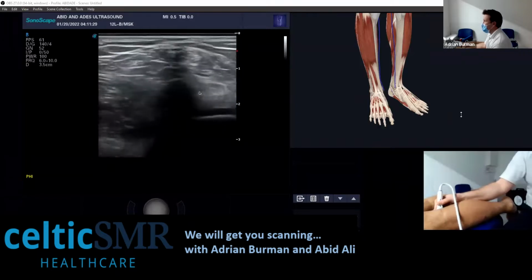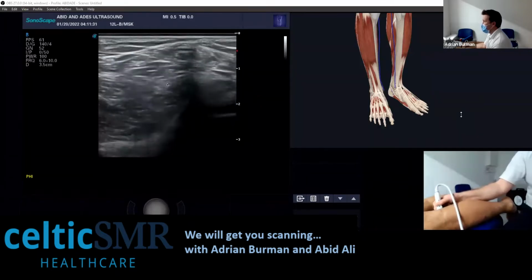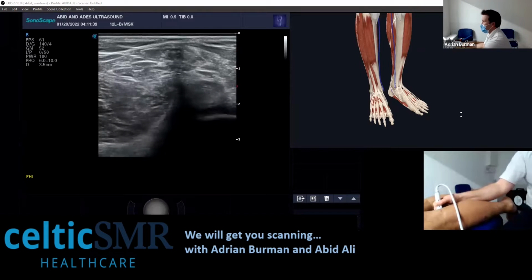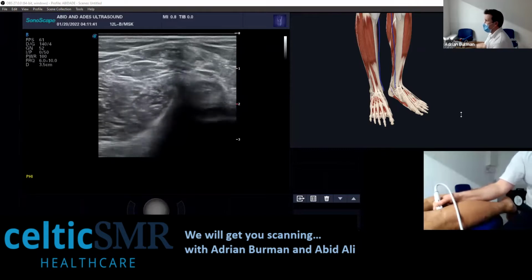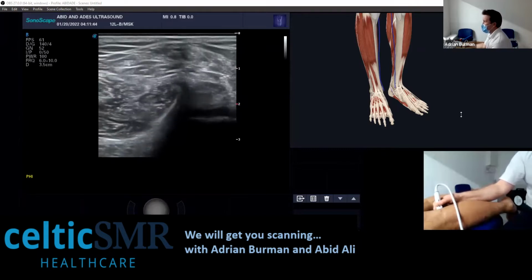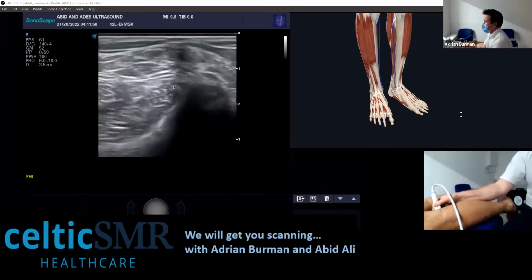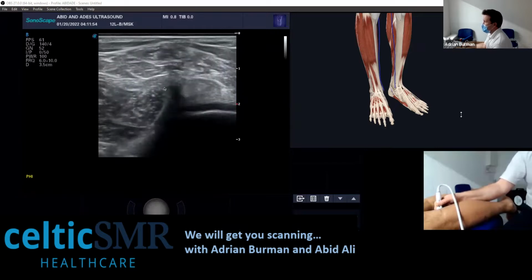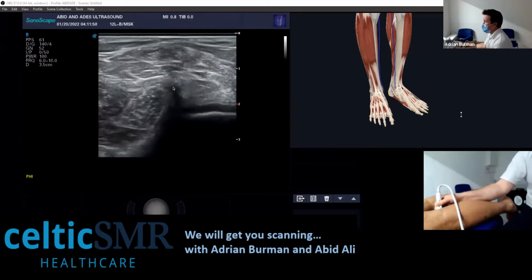And then if you come across a little bit, you'll see here, which is your medial head of gastroc. Now, if I bring my focus down, that will all sharpen up for you. There you go. Okay. So you're looking for this apex of the medial head of gastroc. And that's the key: semimembranosus tendon and your medial head of gastroc. So this is your bursa here. So this is where it will come up, and this is your sort of speech bubble.